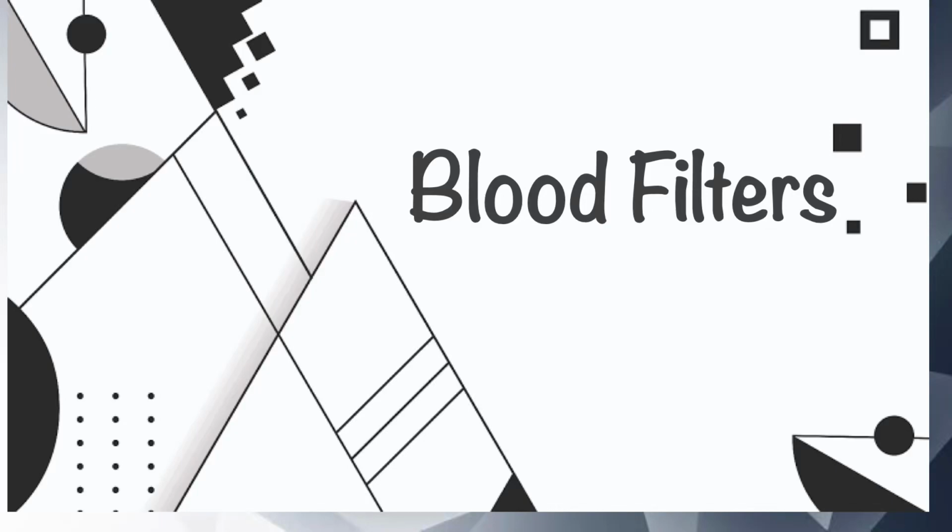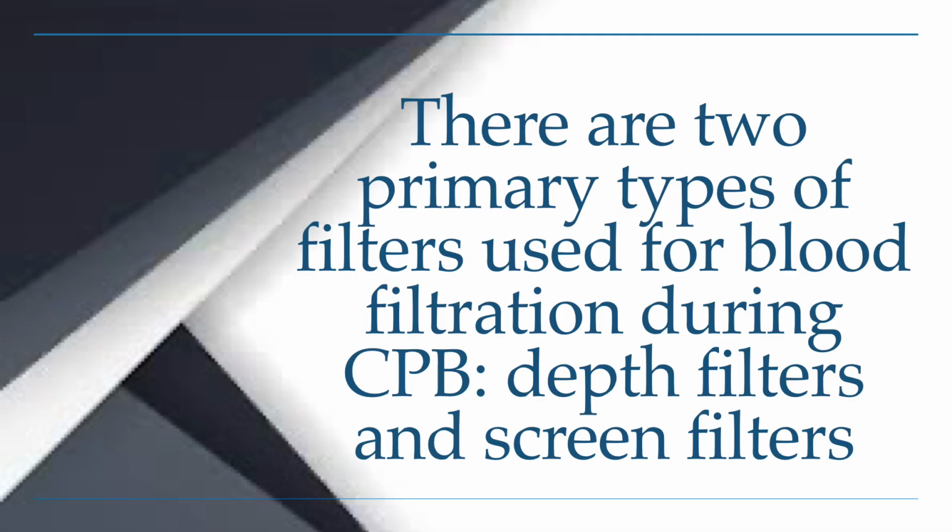Blood filters. There are two primary types of filters used for blood filtration during CPB: depth filters and screen filters.